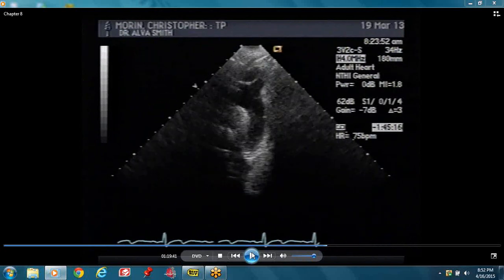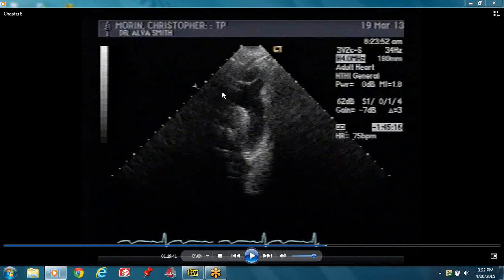This is your suprasternal notch — you should be practicing this view. This is the arch of the aorta, then you come to the descending aorta. You could see a little portion of the ascending aorta, then the arch and then the descending aorta.